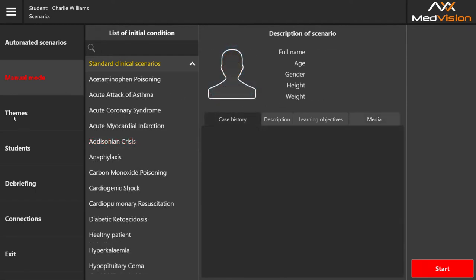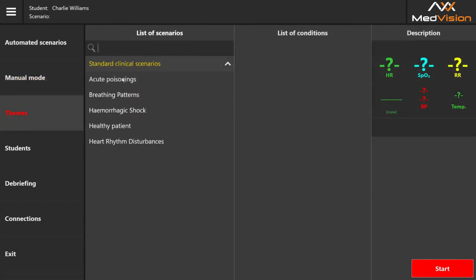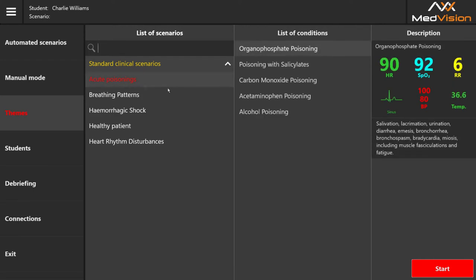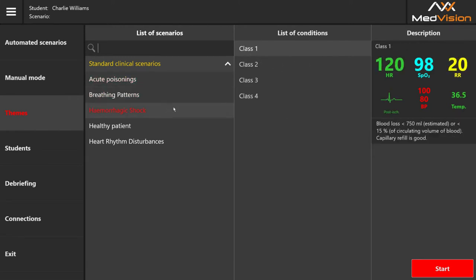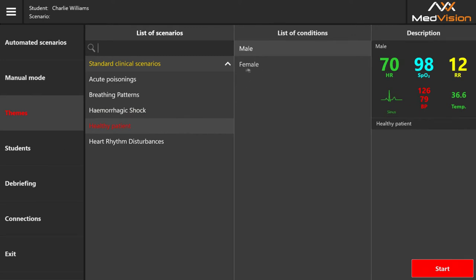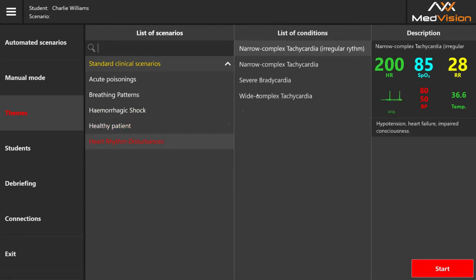More importantly, we have themes. Themes are a hybrid between manual and automated scenarios — we give you a few examples of how they're supposed to look like and encourage clients to experiment. For example, we have acute poisonings, organophosphate poisonings, breathing patterns, hemorrhagic shock classes, healthy patients — male and female — and heart rhythm disturbances.